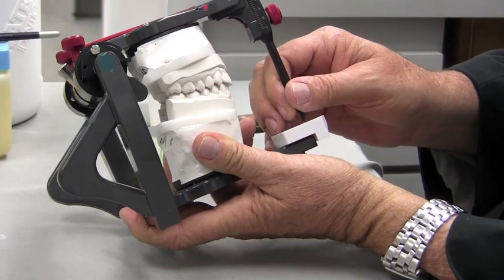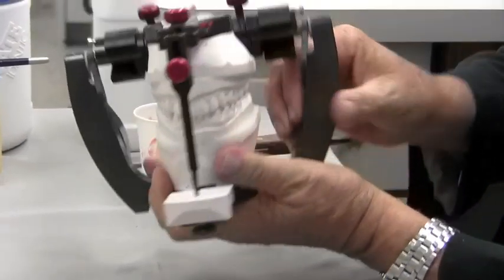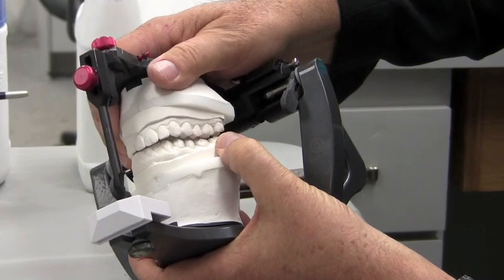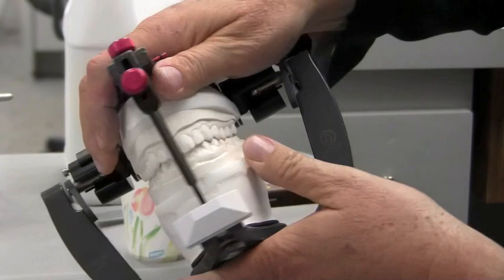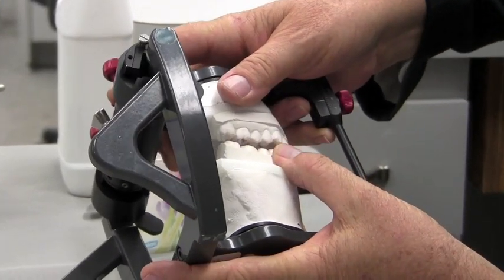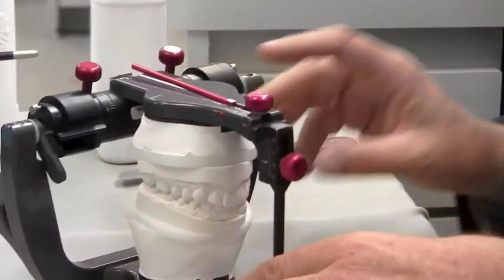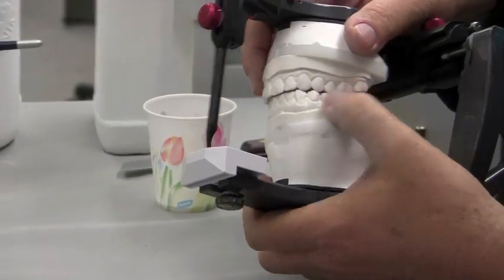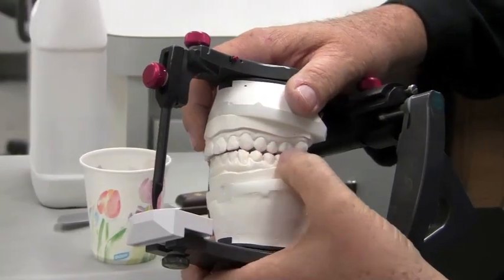In other words, when I move this mandible to the right, I want to make sure that on this side I'm not having any balancing interferences in the posterior that are affecting my guidance. So I visually look to make sure that everything is lifting off back here when I go into that movement, and I look that everything is lifting off when I go into left lateral movement — that I have no balancing side interferences. And if I do have some, I will generally see that it causes my teeth on this side to lift off prematurely and not guide on the cuspids and maybe group function on the bicuspids.